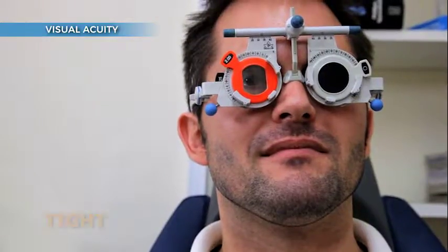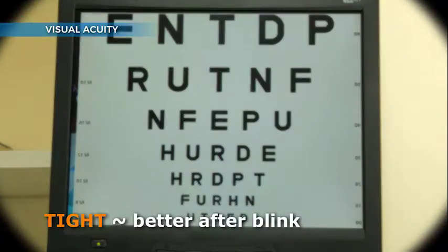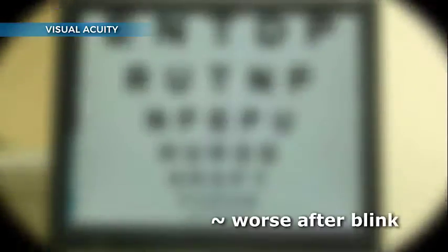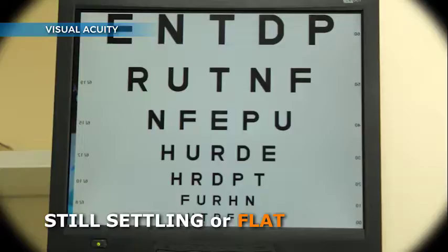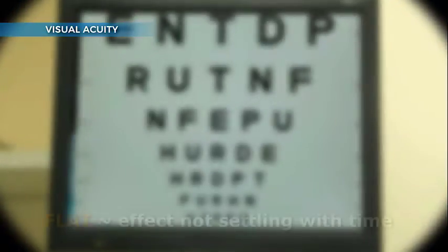The visual acuity found with an optimal fitting lens will remain stable during blinking. A tightly fitting lens will result in the visual acuity improving after the blink, then deteriorating again as the patient stares. If visual acuity becomes worse after the blink and then clears on staring, the lens may still be settling, or this may indicate that the fit is flat. If this does not settle with time, then this confirms the fit is flat.